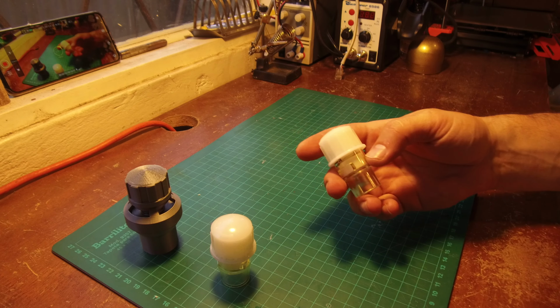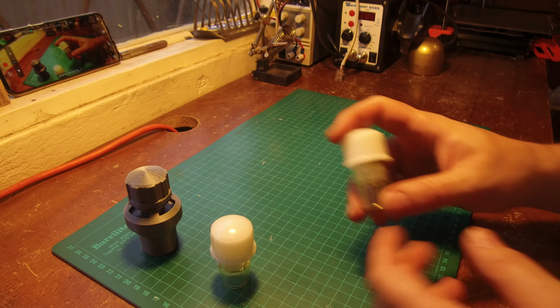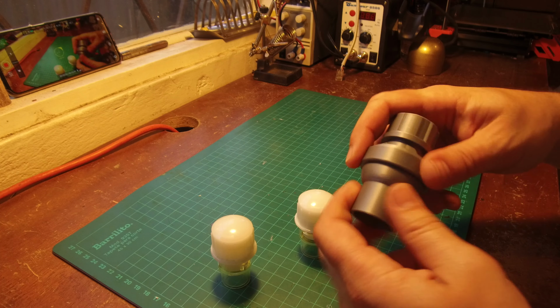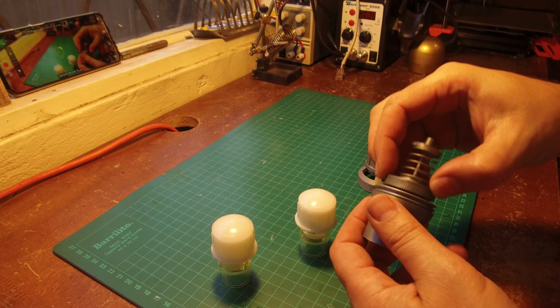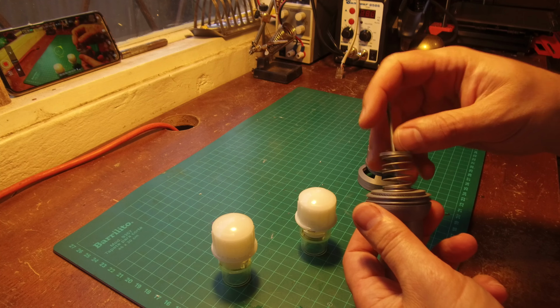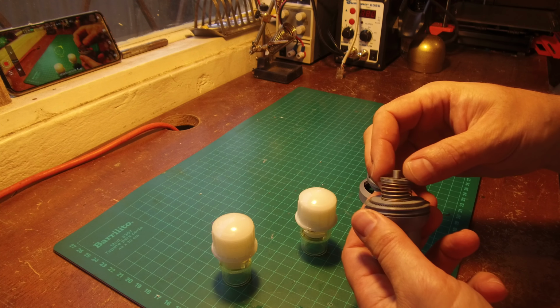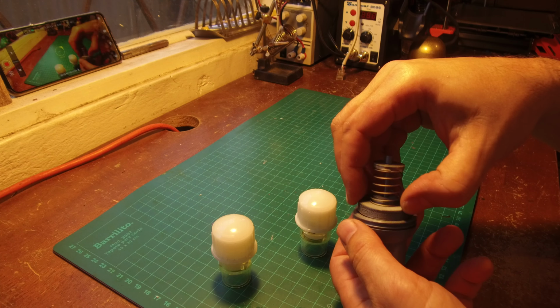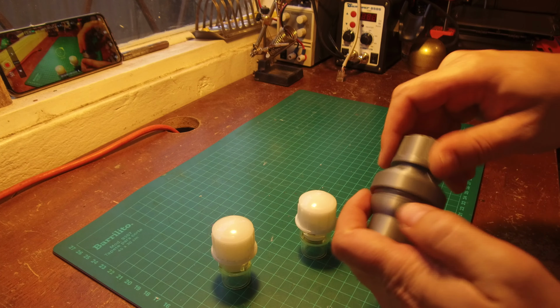Now these PEEP valves, positive end expiratory pressure, basically hold pressure inside the circuit. This works the following way. This thing blocks the airway and is held in place by this spring. When you screw this down, the spring pushes harder against it, so it has more pressure in the airway. When there's too much pressure, this will go up and there will be pressure relief, right?